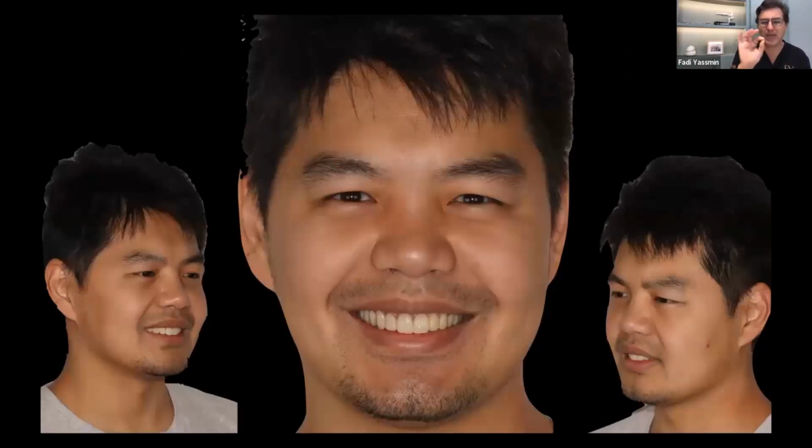Obviously, the final pink ceramic will be matched specifically for the patient. But in terms of a mock-up, we were able to use a shell, show the proportions on the anteriors, create some gingival architecture and harmony, and show the patient, motivate the patient, that this is a possible treatment outcome. And we can see the difference.